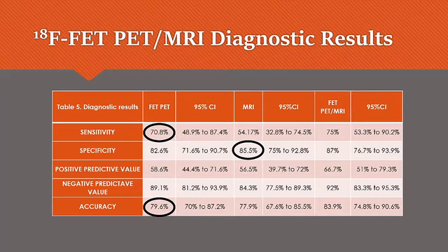These sequences are not standardly done for normal oncology brain workups and do help in ascertaining information like metabolic tumour volumes, which aid in reporting. Overall, the combined FET-PET MRI imaging demonstrates increased percentages for all diagnostic result categories.